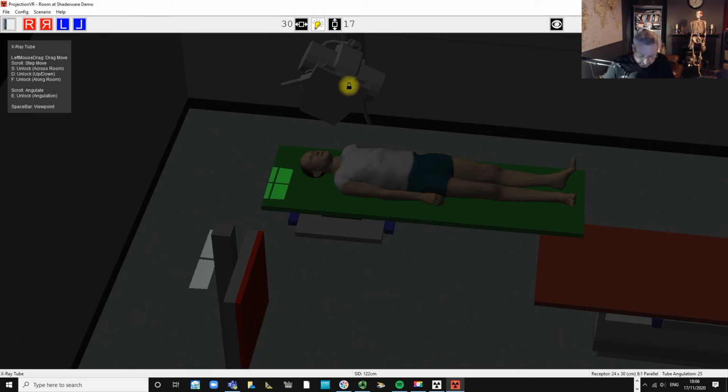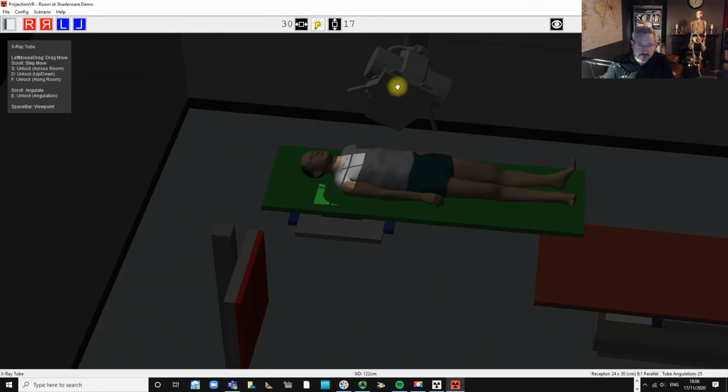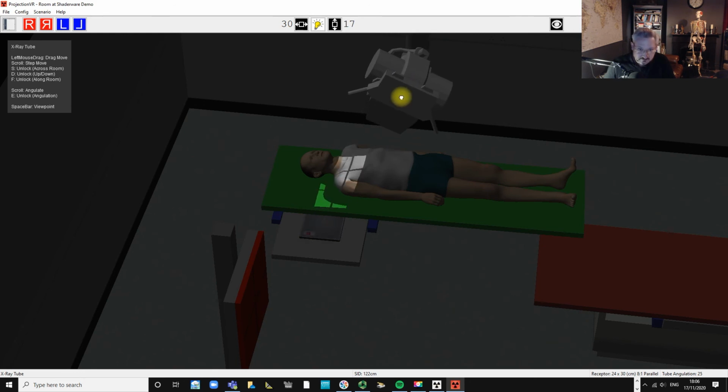If I do that, F, move it across here, and then bring this up to meet it, and bring this across. This is one option. And bring that across again. But I can't do that because I'll get grid cut off. I'll just show you what happens.